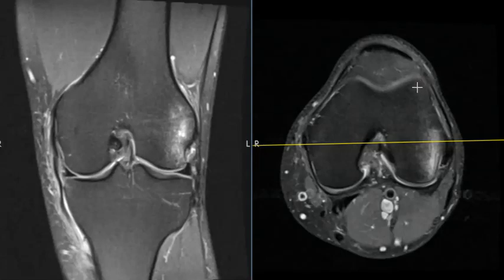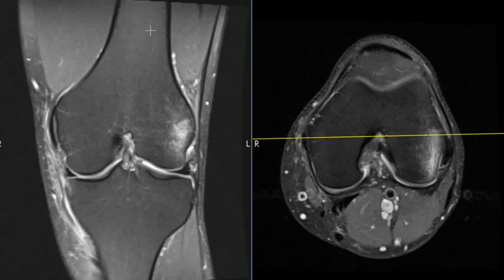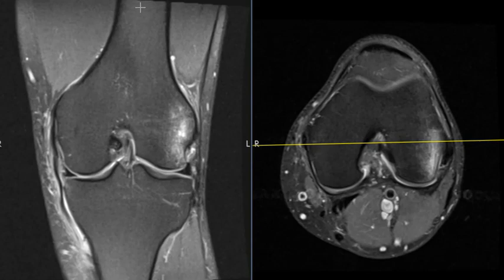Hello, this is Dr. Gay from First Sick MRI. This is a 34-year-old male who fell recently; he has diffuse knee pain. On this view we can see the problem. This is the femur, the big thigh bone coming down. To get oriented, it has a lateral side called the lateral condyle, and beneath this is the lateral tibial plateau. Sandwiched between those is a little black wedge called the meniscus, which looks normal on this side.